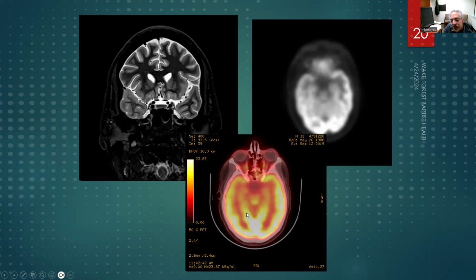And what's interesting about this is the brain normally uses glucose. So if we were to measure anyone in the audience's brain on a PET scan, you use glucose normally, so your brain would light up with glucose all over the brain. But this patient was brought in between seizures, so they're not actively seizing at the time of this PET. And although during a seizure, metabolic activity goes high from ATP production and all that neural activation, interictally, you tend to find a quiescent hypometabolic state of the area that's involved in the ictus because of this resource depletion during active seizure.